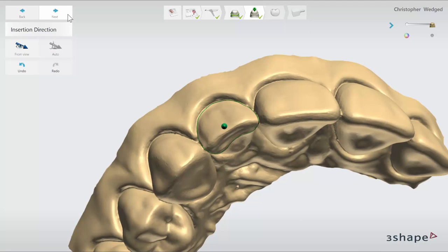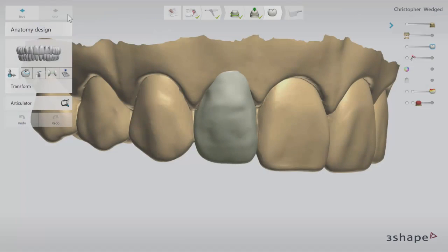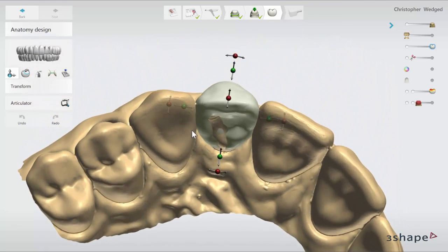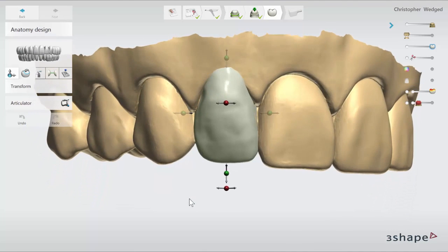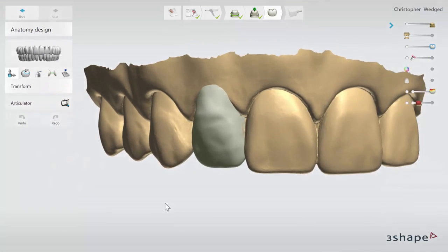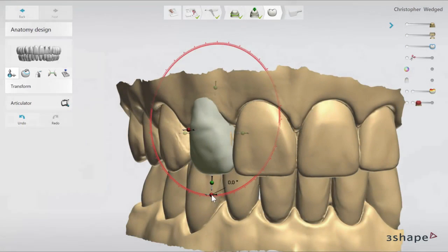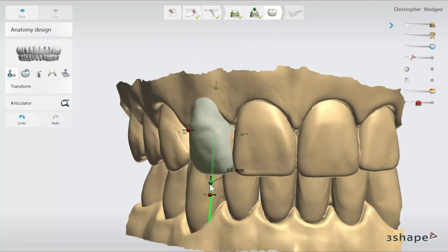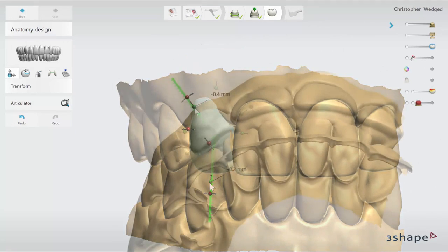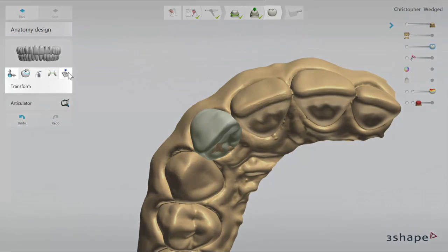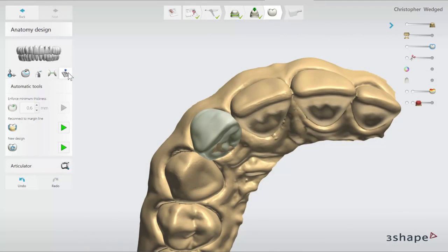Having the insertion direction set, click next to go to the anatomy design step. At this stage the software gives you an initial placement of a tooth. Start with setting it in the correct position in relation to the other teeth in the arch and antagonist. The transform tool will help you with this — use the control spheres to move the tooth or click on the tooth and drag. Having the right position of the tooth, go to automatic tools and click reconnect to the margin line to have it connected to the margin line.